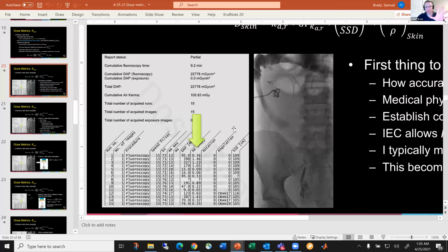There is the dose capture, the dose screen. This is physically a DICOM image, and this is good because you can visually see everything here and do all your dose calculations. And then there is a structured dose report that you don't physically see, but it is what you send to your dose reporting software.